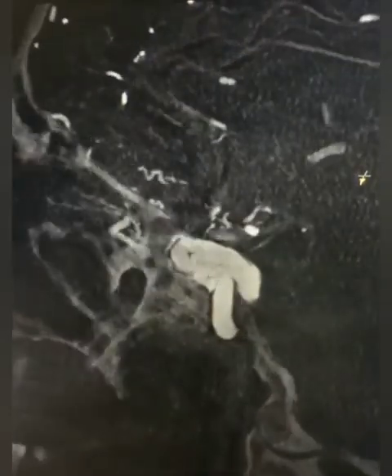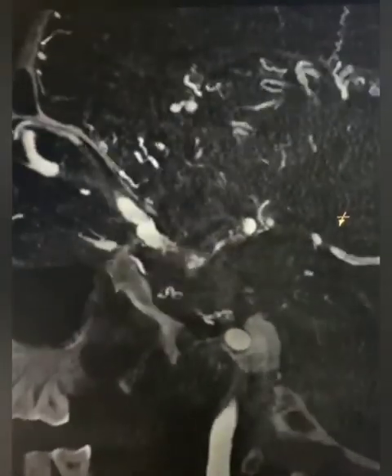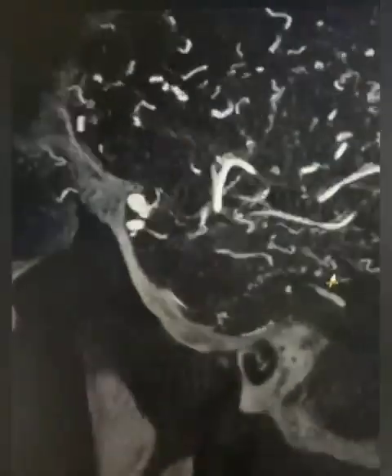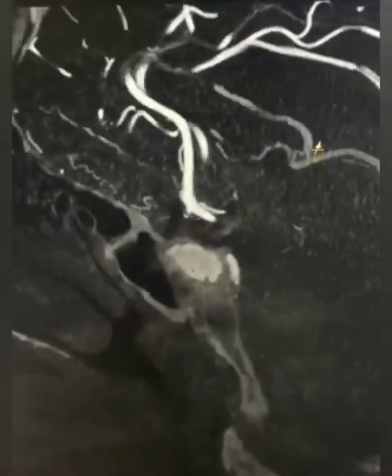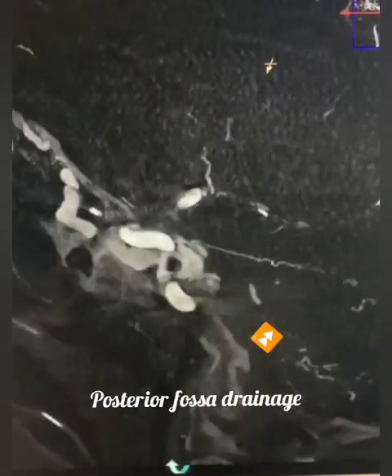A patient with direct CCF, on expert CT angiography, one can visualize the exact site of the fistula. The venous drainage is anteriorly into both superior and inferior ophthalmic veins, as well as drainage into the superficial middle cerebral vein, causing significant cerebral venous congestion. Through the intercavernous sinus, it communicated with the opposite side, which in turn had an anterior drainage into the ophthalmic vein and posterior drainage into the cerebellar veins, causing cerebellar venous congestion.